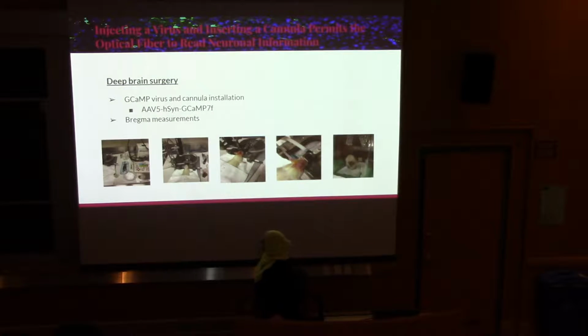So here's a sneak peek of one surgery we did. The tools are right here, and we shave the rat's head, and then we install the virus and cannula. After that, we seal it with dental cement. And then finally, the rat's doing well. We keep it on a heating pad, so it eases the healing.